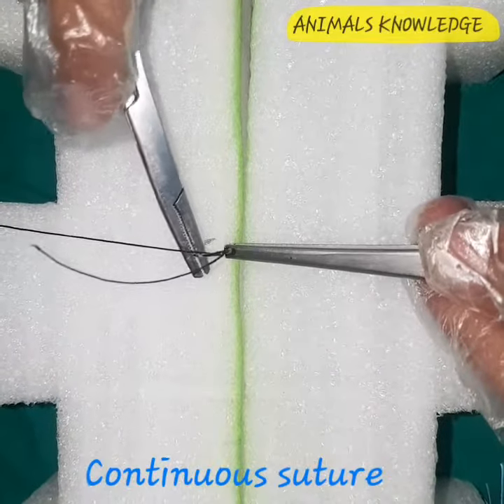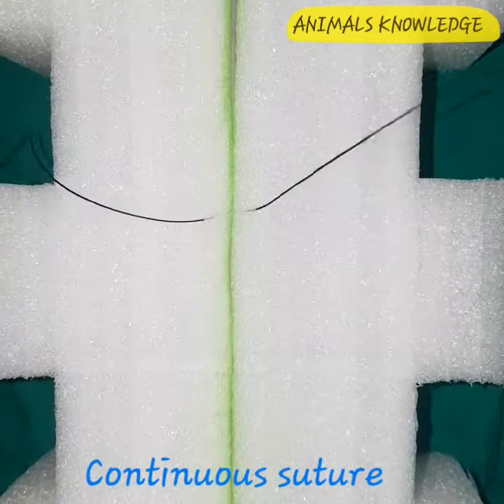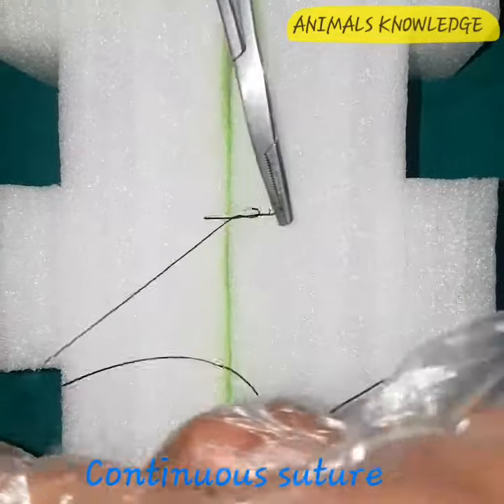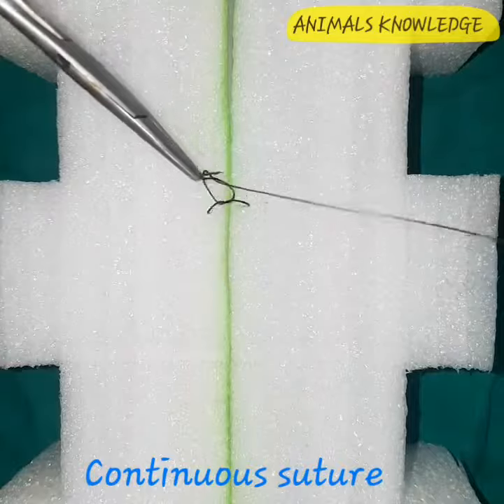First, take the bite right angle to the incision point. Cross the needle deep into the tissue and pass the needle out from the other end of the incision. Tie the simple knot or surgeon knot — it is the choice of the surgeon.